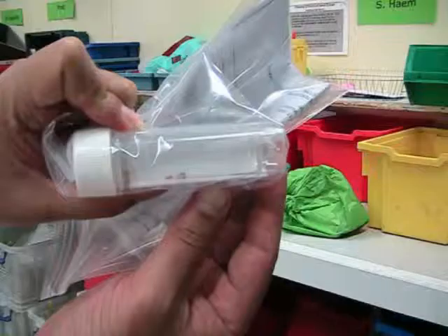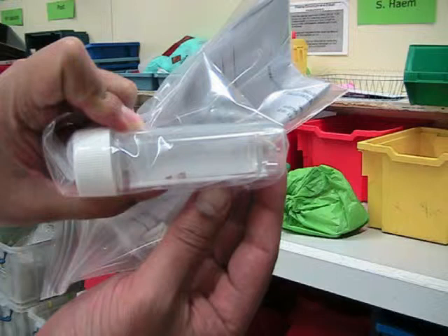There are some gallstones there as well, quite an interesting one. I don't know if you can see the actual stones in there. These can be tested for what composite they are, so that the treatment can be based on this. If they're calcium, they can be treated using treatment or drugs that will destroy the calcium stones. Again, these are done in biochemistry.